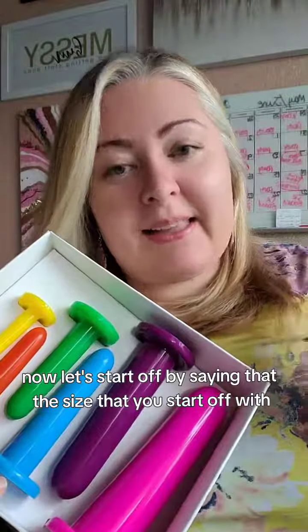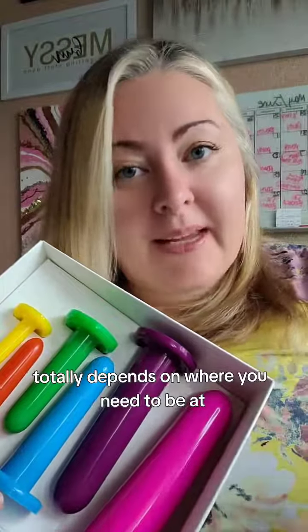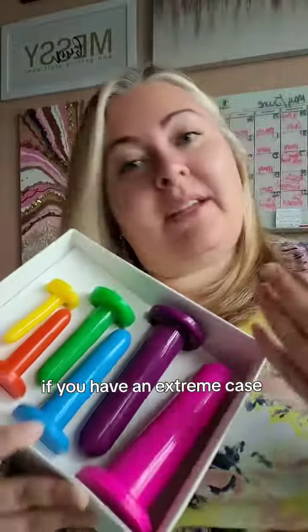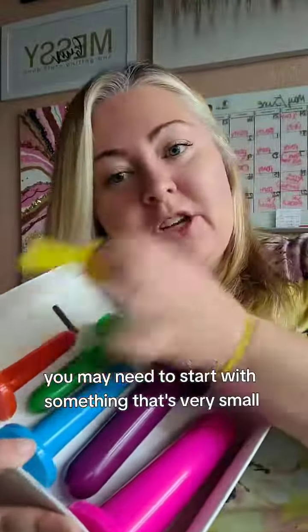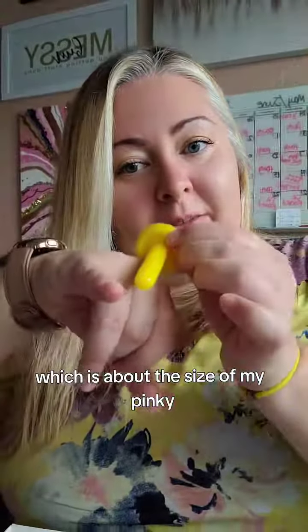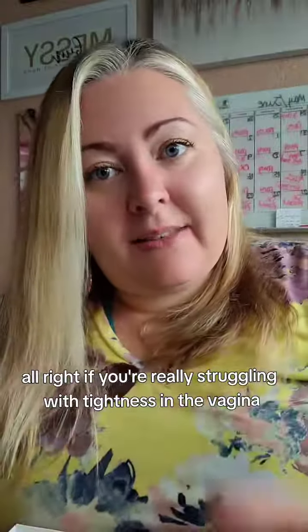Now let's start off by saying that the size that you start off with totally depends on where you need to be at when you first get started with using a vaginal dilator. If you have an extreme case, you may need to start with something that's very small, which is about the size of my pinky, all right, if you're really struggling with tightness in the vagina.